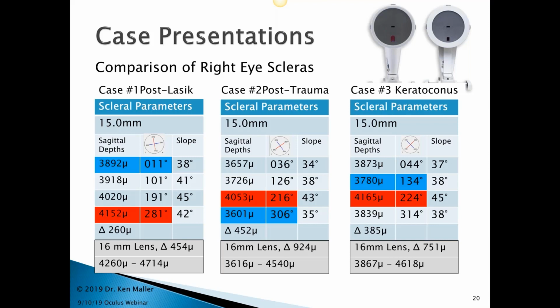The Eaglet does two cameras to get the elevation data across the measured distance, and then of course the SMAP 3D does a stitching model of 3 different captures: the central, straight across, superior and inferior. So you're talking about very, very different technologies. I've had a chance to see those, but I haven't personally worked with those, so I can't comment specifically on those. I can tell you, though, the fact that I don't have to deal with a tear film has been an incredible plus after all these years of dealing with topography that does rely on tear film and seeing the problems that tear film problems create.